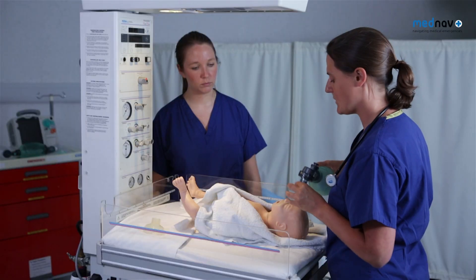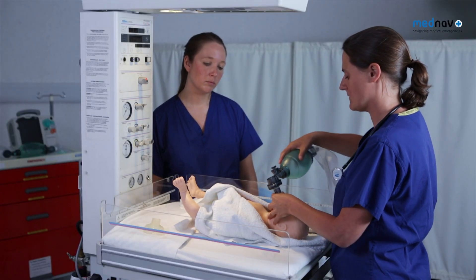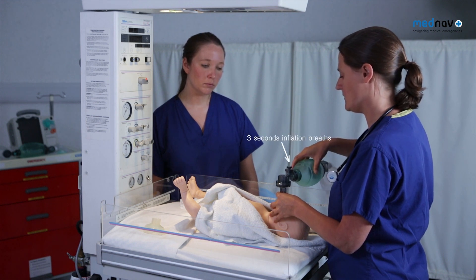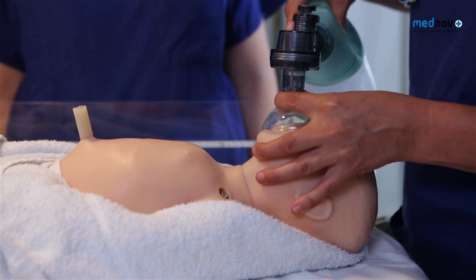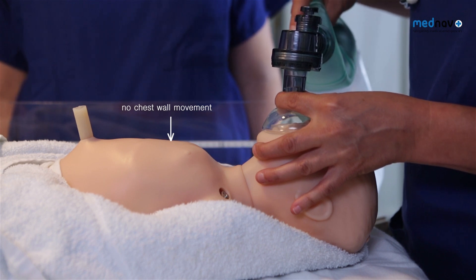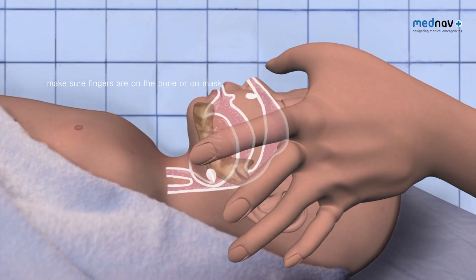Hold the mask with a pincer grip and deliver 5 inflation breaths, counting 1-2-3 for each breath. If the chest wall did not move, perform a single person jaw thrust.